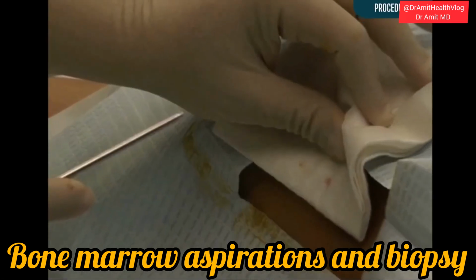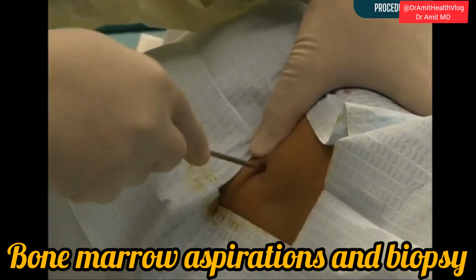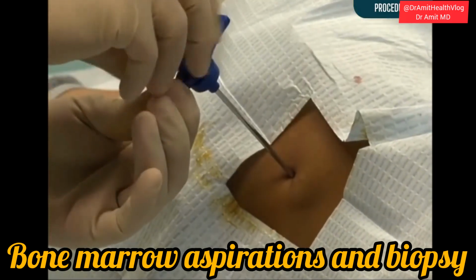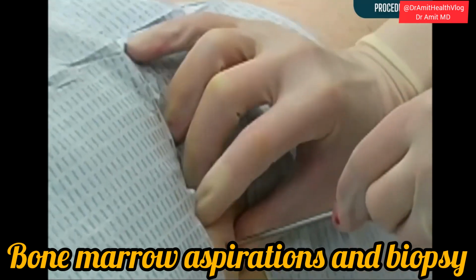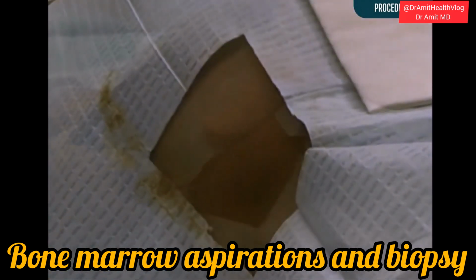Bone marrow biopsy is often done following a bone marrow aspiration. Maintaining sterility, obtain a bone marrow biopsy needle. Holding the needle between your palm and index finger, insert the needle into the patient's skin and advance until it touches bone. If an aspirate has been performed, the same entry site through the skin may be used for the biopsy. However, a skin incision may be indicated if only a bone marrow biopsy is being done, or after an aspirate to allow for entry of the larger biopsy needle.